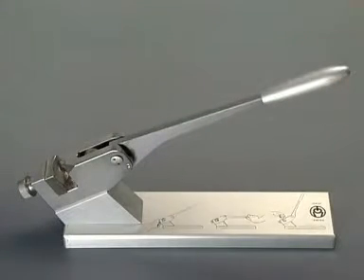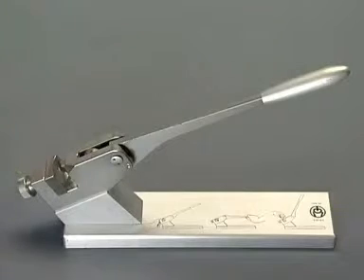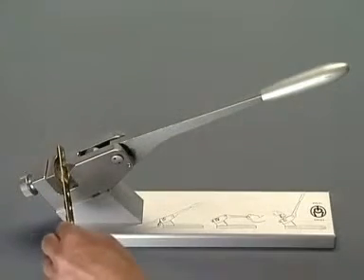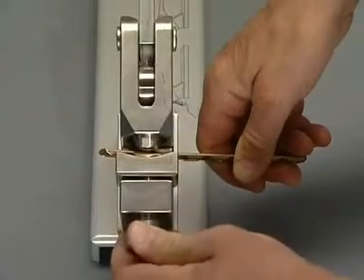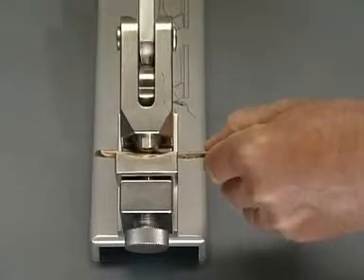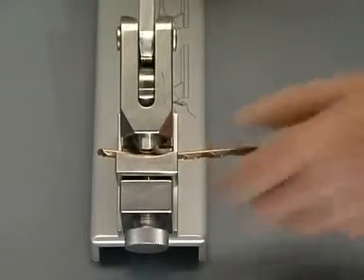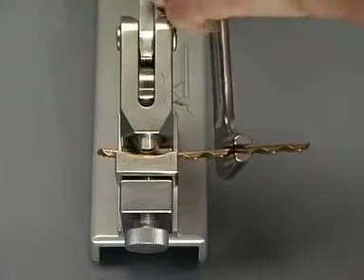To begin, the handle of the bending press must be aligned with the instrument. Adjust the screw on the block. Insert the plate and tighten the screw to hold the plate in position. Bend the plate to correspond to the template. Use the bending iron to twist the plate.